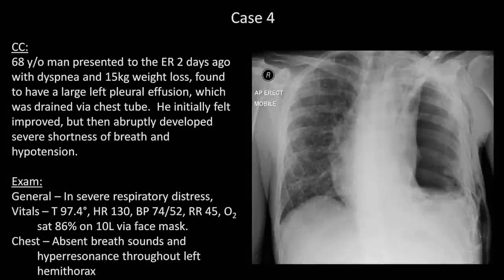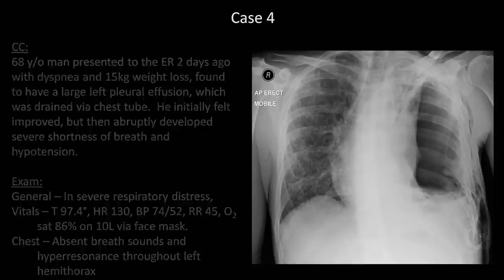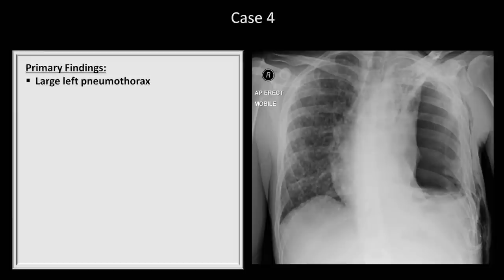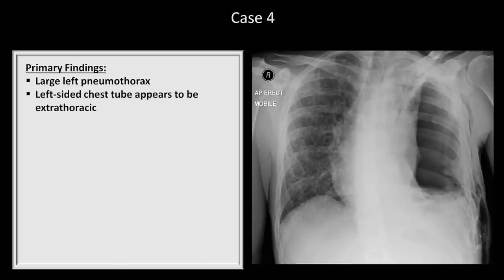Case 4. A 68-year-old man presented to the ER two days ago with dyspnea and weight loss, found to have a large left pleural effusion which was drained via chest tube. He initially felt improved but then abruptly developed severe shortness of breath and hypotension. On the left, where the left lung is supposed to be, it is completely devoid of lung markings — a large pneumothorax. This appears to be related to some technical problem with the chest tube, which is coiled up at the bottom of the film and appears to be extra-thoracic — it looks like it just fell out. The rightward shift of the heart and mediastinal structures strongly suggests he has a tension pneumothorax.